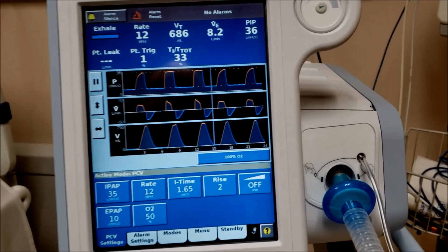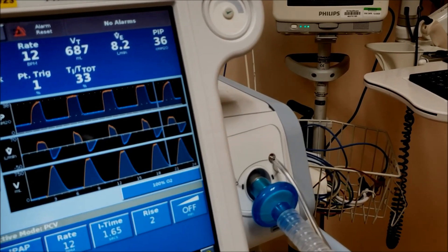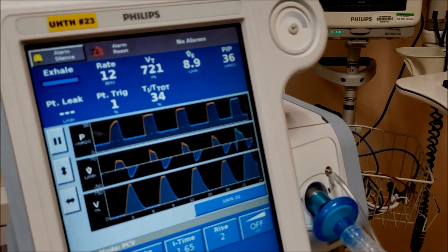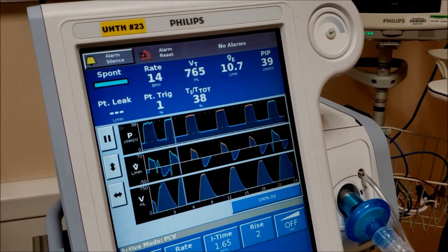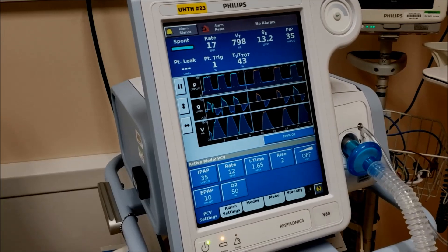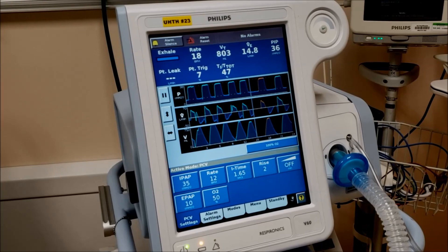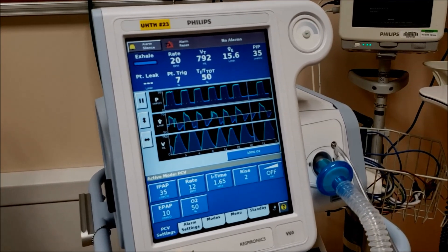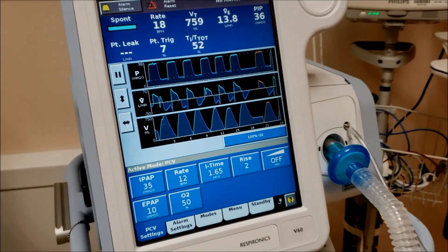PCV will also respond to a spontaneous breath. Watch — there's your blue waveform. If you look at the top left it says 'spontaneous,' meaning it was triggered by the patient. PCV finishes the breath for you, similar to AC mode. You can see we now have a spontaneous rate and a percentage of patient-triggered breaths. We should have zero leak because we're hooked up to an endotracheal tube.